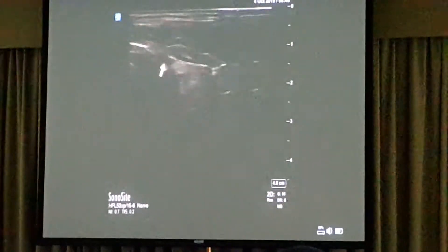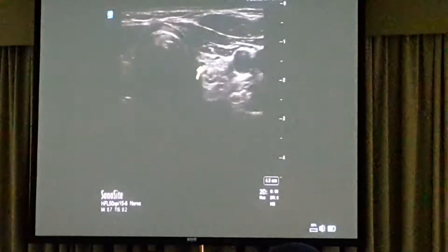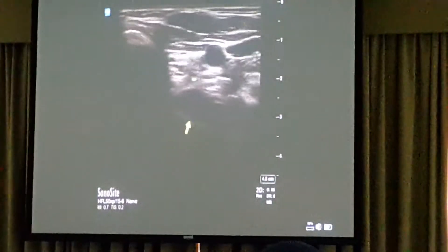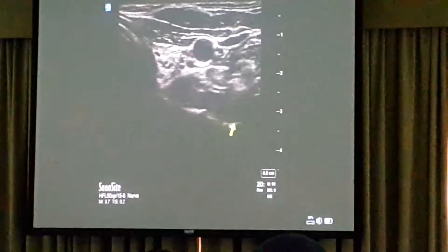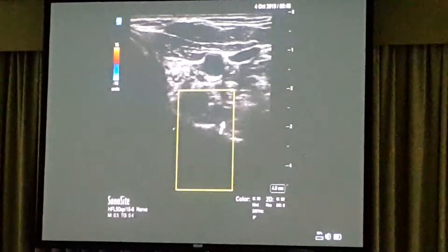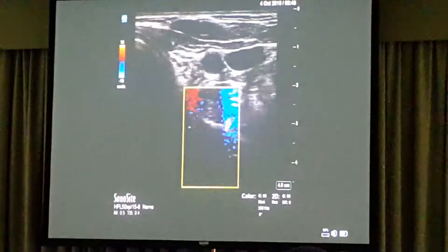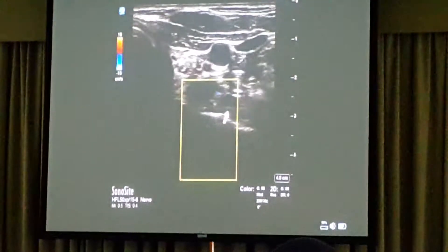So just to recap: start at the midline, look for the structures — this trunk here — you've got yourself a thyroid gland, and you look for the bottom bit where you see a bony shelf, and this is very flat. And what I'll do, I'll put a color Doppler to see if you can pick up the vertebral artery pulsations — and you can pick up the vertebral artery pulsations — so you know that's the C7 level.